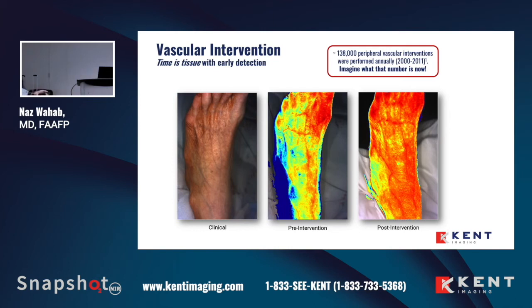But you can clearly see with the colors alone that post-intervention, we were able to get significantly more oxygenation to the limb.